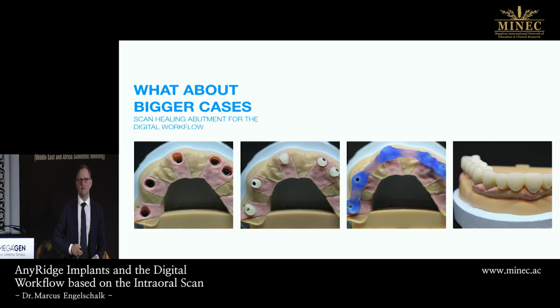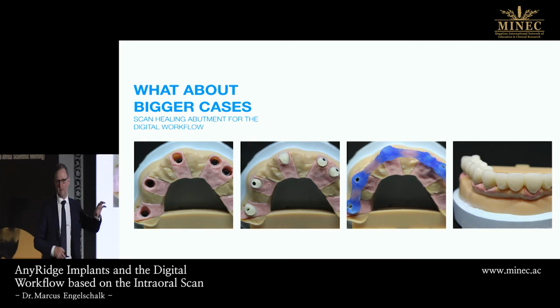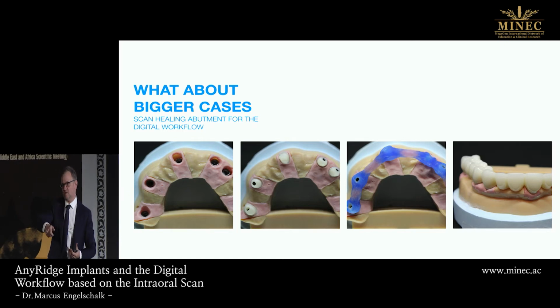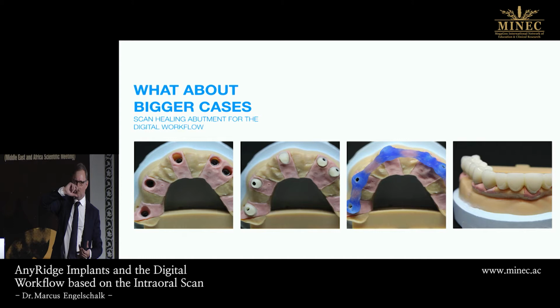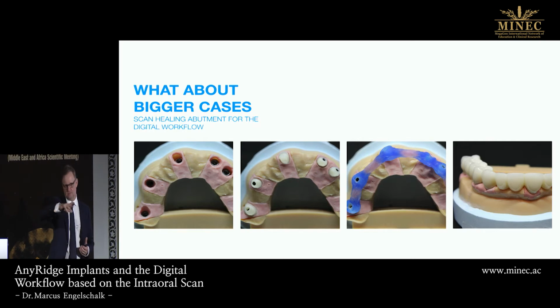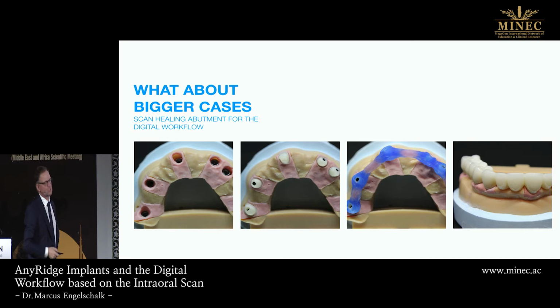But you see, this is a help to bring in the abutments into the mouth, because you have 6 positions. 6 positions on 6 implants means 36 possibilities to be wrong. Oh, no, not that much, but you know what I mean. So, this is very important. This is the bridge.